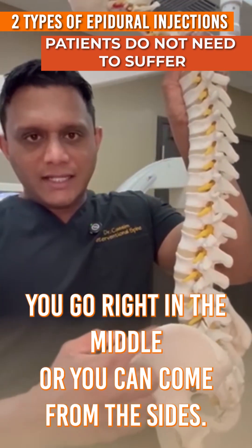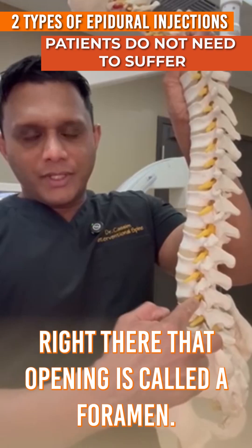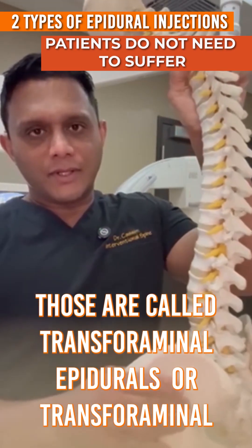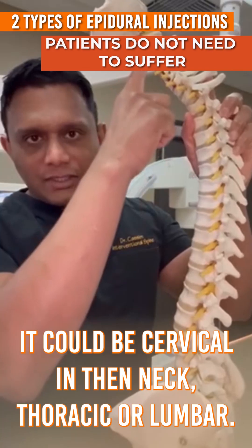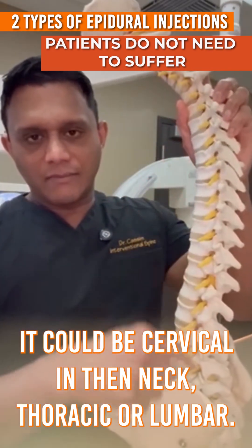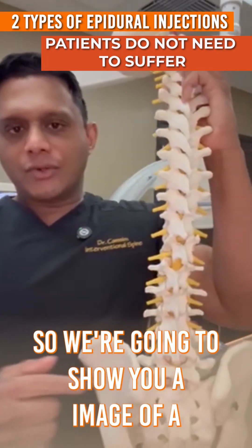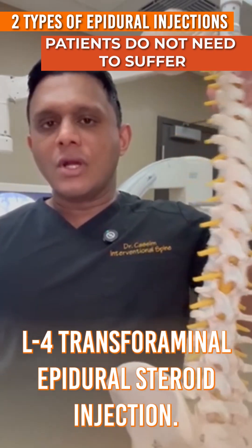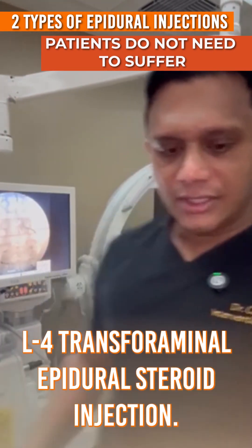Or you can come from the sides, right there. That opening is called a foramen. Those are called transforaminal epidurals. It could be cervical in the neck, thoracic, or lumbar. We're going to show you an image of an L4 transforaminal epidural steroid injection.